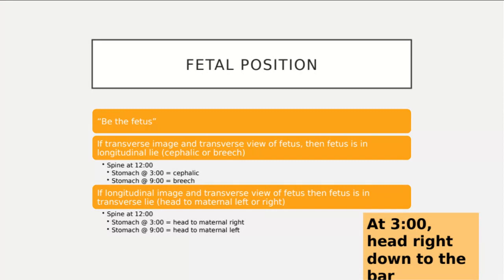Now, if you were in my little session at the beginning of the summer, you came in and you saw a bunch of circles on the wall and it says, you know, at 3 o'clock, head right down to the bar. And you're like, what are you talking about? Like, I'm not even 21. Why are we saying this? So this is going to be the kind of acronym, I guess you could say. It's not really an acronym, but the thing to remember how to determine fetal positioning based off of an image, right? And based off of what your transducer is doing.